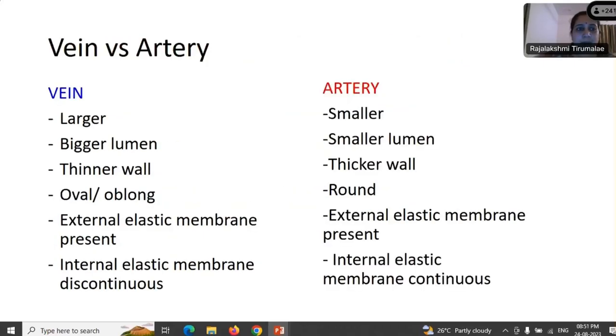Okay. So can I ask for the comments from the chairpersons? You already mentioned the difficulty in demonstrating the arteriole. I would just add that many cases present as livedo reticularis with gangrene of one of the digits or toes. In such cases, it's even more difficult to decide the exact site of biopsy when there are no nodules. So one really has difficulty, and multiple biopsies may be required. Sometimes the Doppler test is helpful.